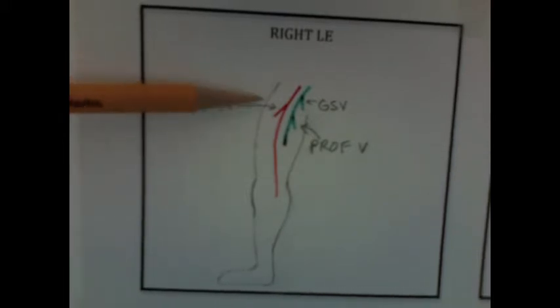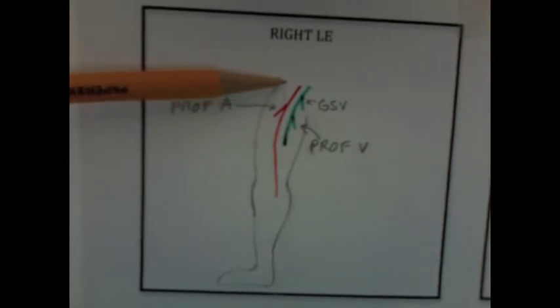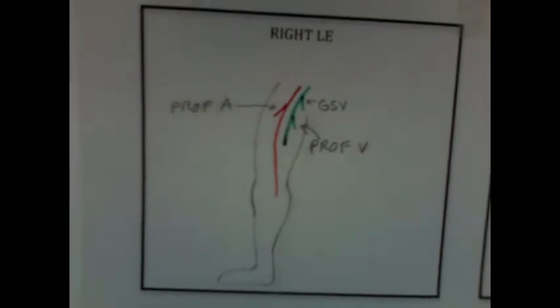And then you'll find the profunda artery, and then the bifurcation of the greater saphenous vein. Everything above that is the common femoral vein. Now if you put the probe down you may see this, a vein all by itself, that is the greater saphenous vein, GSV.